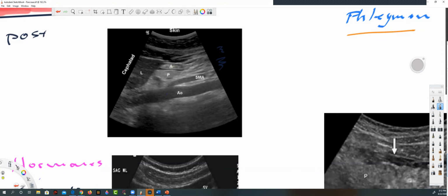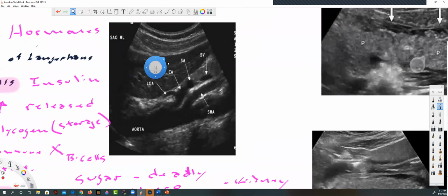Okay. So A is for stomach. It's actually for the antrum of the stomach. So that's the stomach up here. Pancreas there. Splenic vein. It's not the confluence yet. We're a little bit to the left of where the confluence would be. That would make this one over here more or less a circle. That's our artery, our splenic artery. We don't see the celiac axis here. We barely see it, I guess. So that's a nice long image there, and even better image actually.